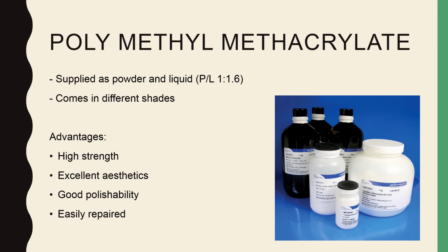The polymethyl methacrylate is supplied as powder and liquid in the ratio of 1 to 1.6. It comes in different shades. It is the same material used in cold cure acrylic in removable prosthodontics. It has the advantage of having high strength, excellent aesthetics, good polishability, and easily repaired. The repair could be done intraorally by having small amount added to the margins after coating the tooth with separating medium.